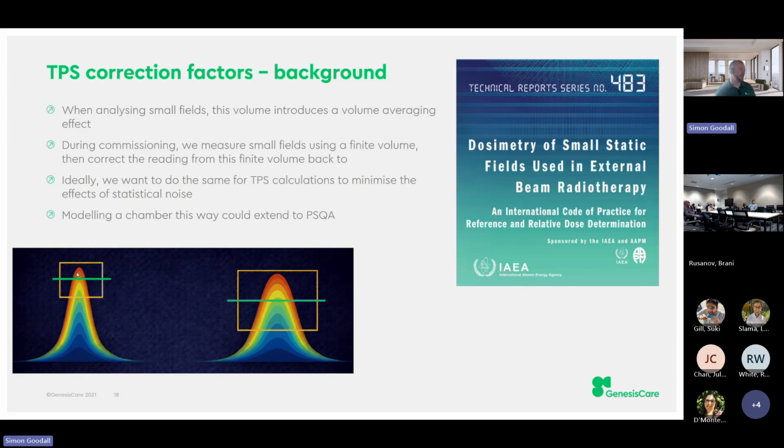Kind of what the green line looks like would be closer to the top. And if you measure over a bigger area, I just realized I didn't have that on, it drags your value down. So when it comes to measuring these things, there are some really well-defined practices: you use an ionization chamber or a detector with a finite volume, you measure the dose, and you can correct that back to a single point dose.